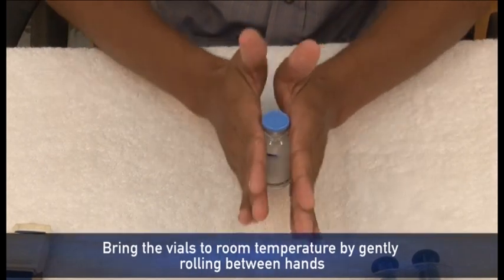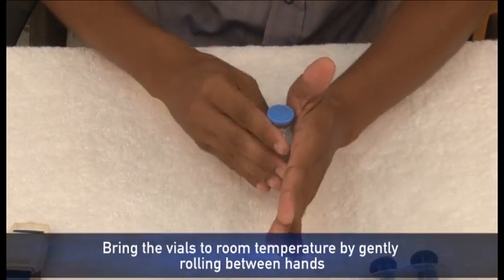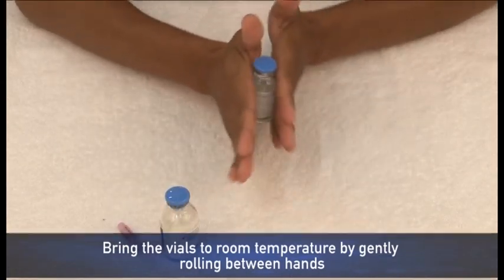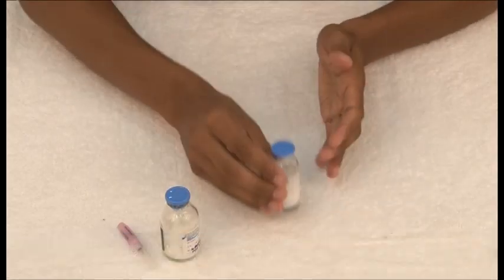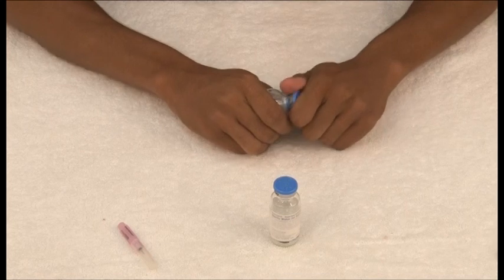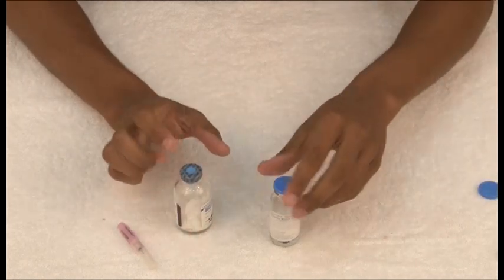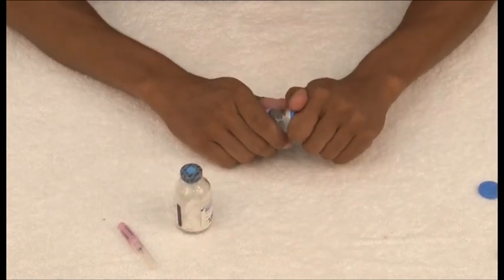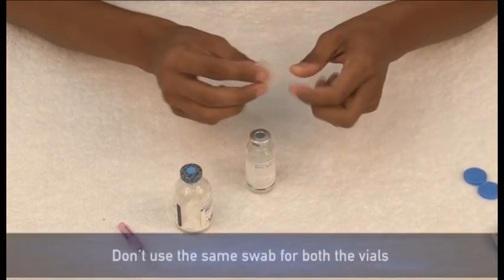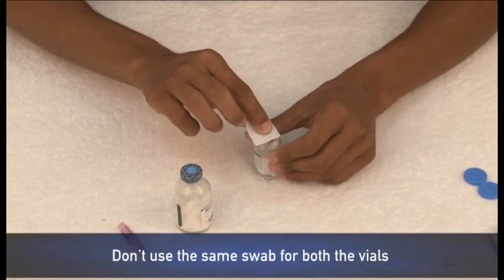Bring the factor vial and diluent vial to room temperature by gently rolling between hands. Let's now get the factor ready for infusion. Remove the caps from the factor vial and diluent vial. Use disinfectant swabs to clean the stopper of the vials.